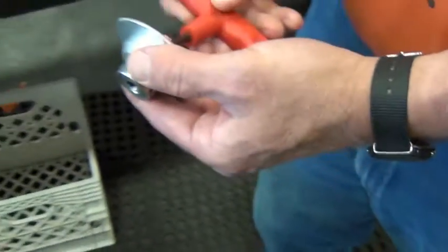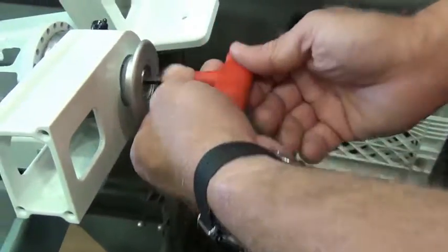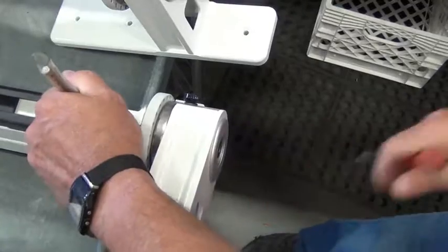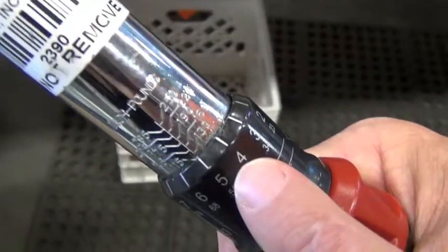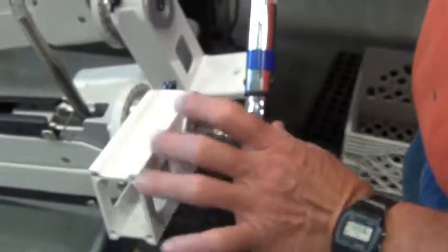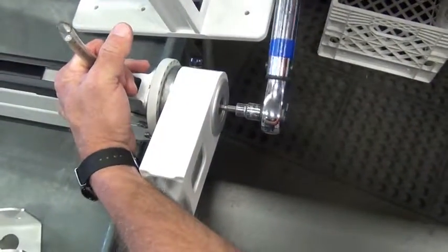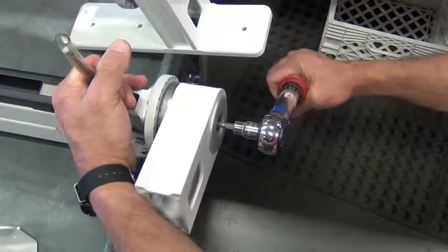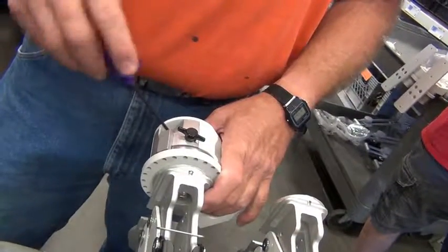The bearing adapter is attached to the bolt in the wall ear assembly. The bearing adapter is torqued to 120 inch-pounds. The set screw in the locking collar is tightened in place.